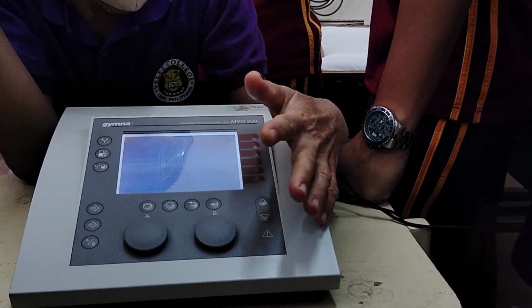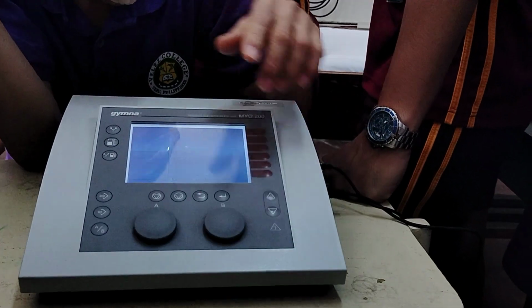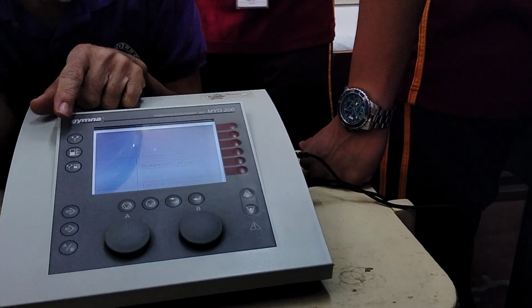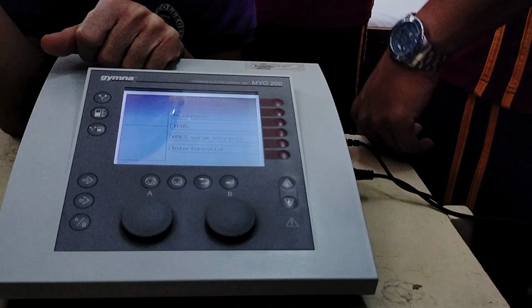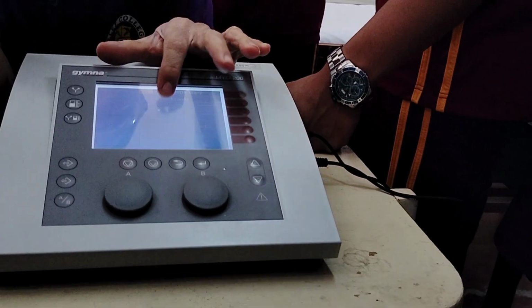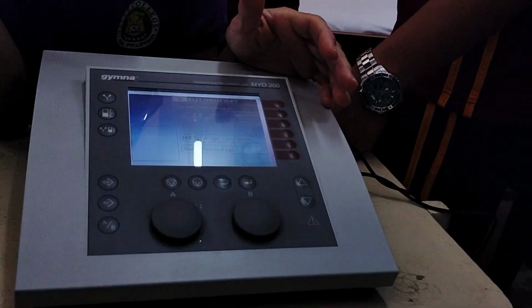Okay? So, going back, with this machine, you have electrotherapy and biofeedback. This is combined. When you press electrotherapy, you can now have unidirectional, although there's direct current, diadynamics, TENS, surge current, and interferential.